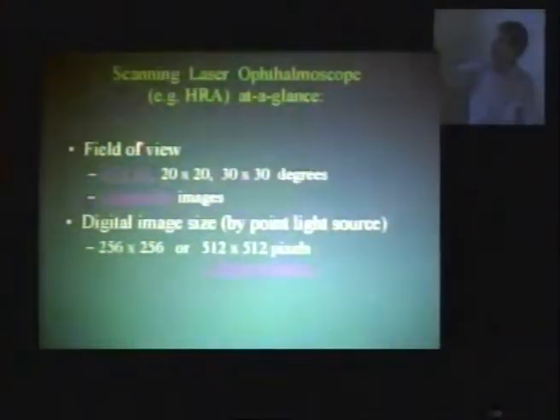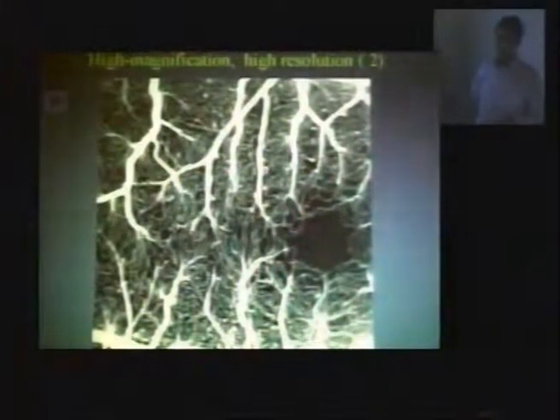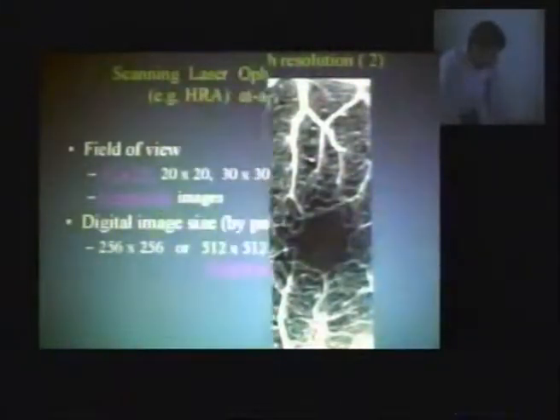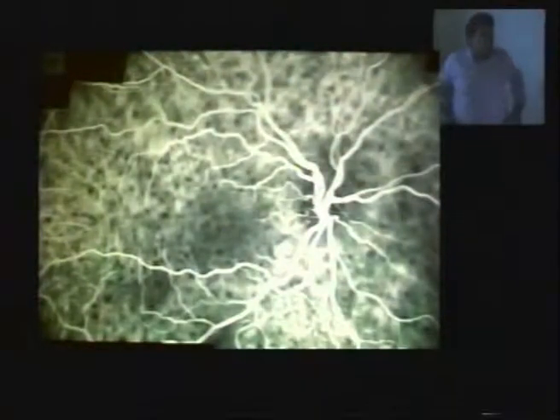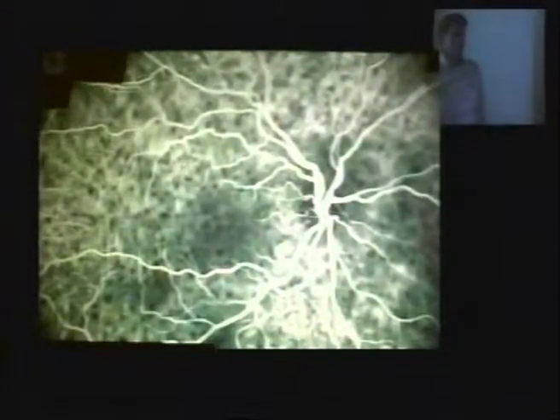What does the SLO do? The field of view, we have 10 degrees. Fundus camera cannot do this. 10 degrees. Only SLO. You do 10 degrees and get very good detail of focal. Because 10 degrees, very good quality with the SLO. But you can do composite images, bigger than fundus camera. And you do it here also for wide angle. Wide angles. You would have a greater resolution with 10 degrees, no? Yes, with 10 degrees is great resolution. Very good resolution. Pixelation. Yes. It's good resolution.